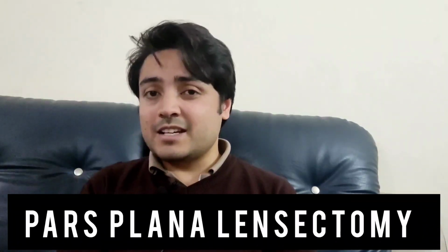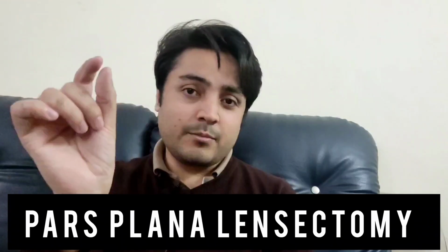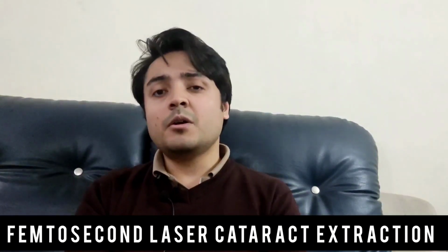And pars plana lensectomy, well, pars plana is a part of the eye. It is in the middle layer of the eyeball, the uveal tract, near the uvea and the ciliary body. Through this technique the lens used to be extracted, but like I said, it is rarely used these days. So we are going to discuss phacoemulsification, which is a part of extracapsular cataract extraction. There's another procedure in this category, femtosecond laser cataract extraction, but we will discuss this in some other video.